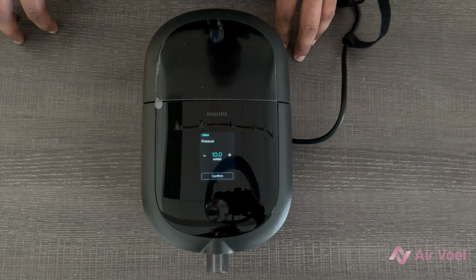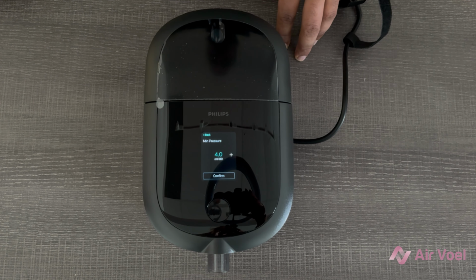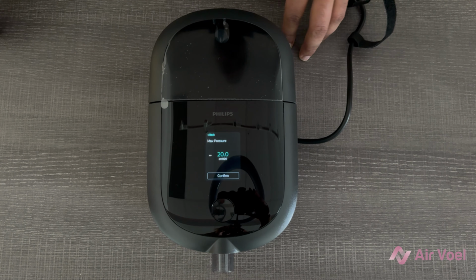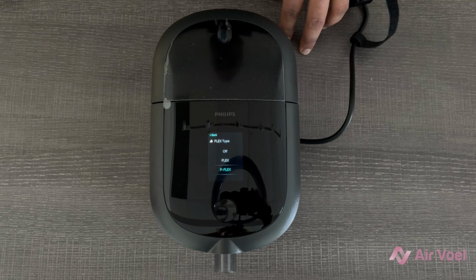You can select which mode you want your machine in. If it's CPAP, it's going to be one constant fixed pressure. If you're using APAP, you're going to be able to set a minimum and a maximum pressure. So you would just follow the prescription settings that your respirologist has suggested.